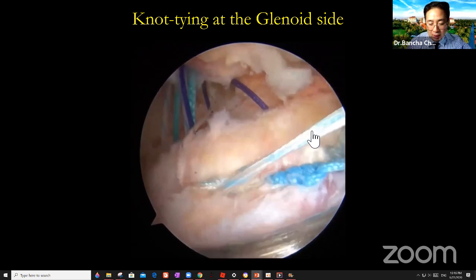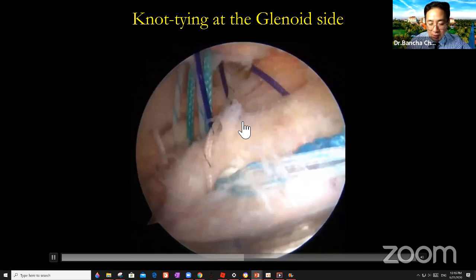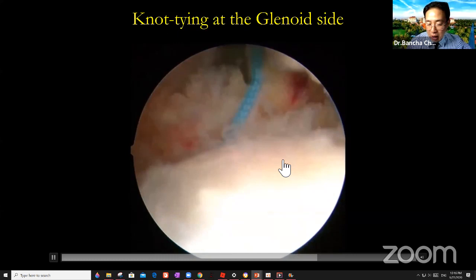You need to secure the graft to the glenoid, okay, that way. And after I tie this graft to the glenoid, then I will pass the rest of the suture into the stump of the rotator cuff. Okay, you see that switching stick is really helpful. And then you see that this purple is the suture that was in the stump of the rotator cuff. Okay, then you pass this suture. After you tie the knot, you pack the suture into the rotator cuff, okay?